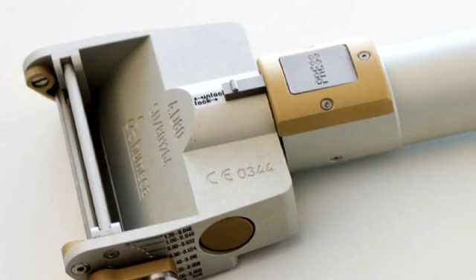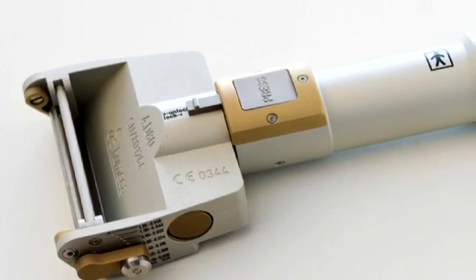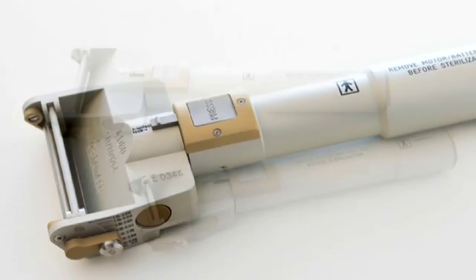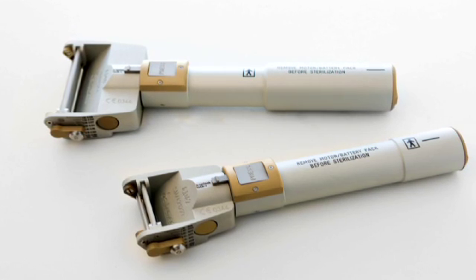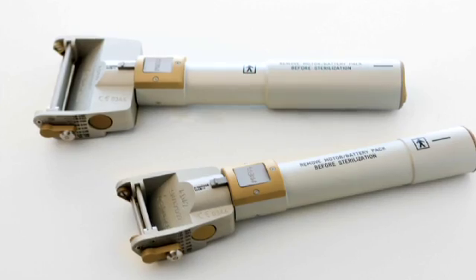The D80 dermatome was developed for more general use. It has a wider head than the D42 and a larger grip that holds a more powerful battery. The following sequences will present the handling of the Humica D42 and D80 dermatomes and show their applications.